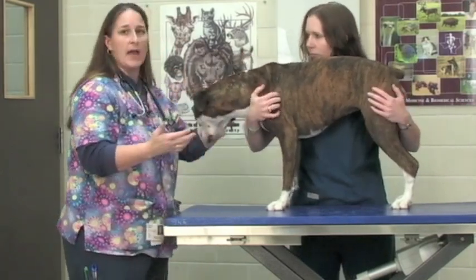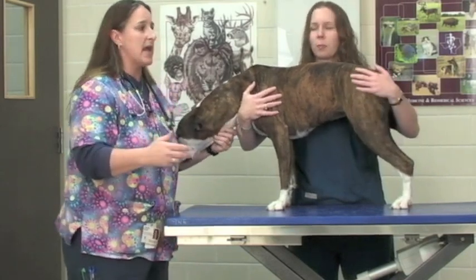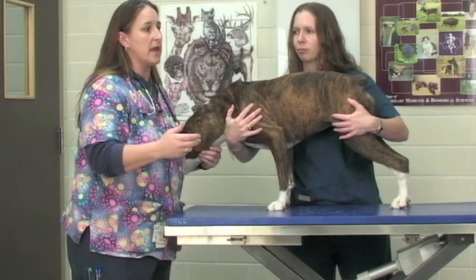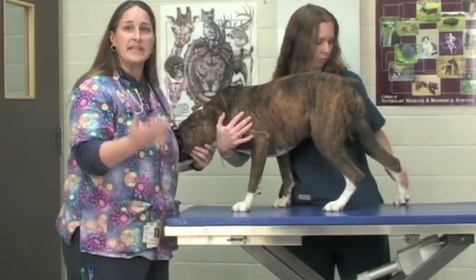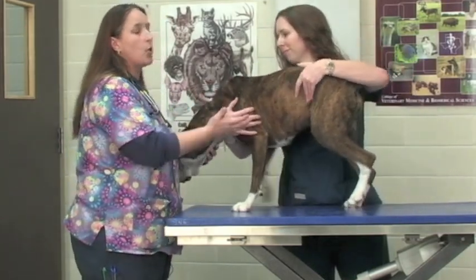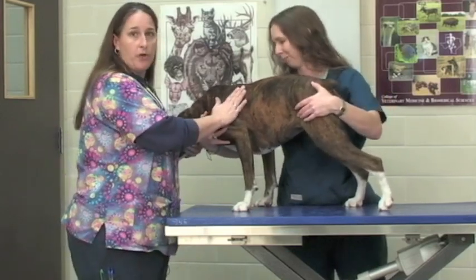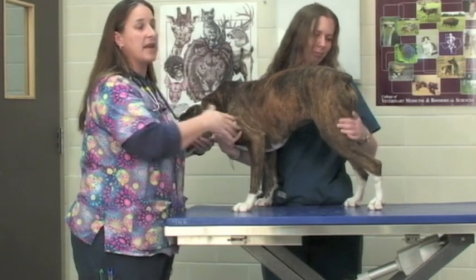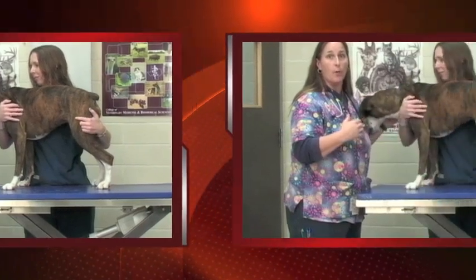When a patient arrives in our ER, we immediately take blood pressures and SpO2 so that we can make sure their oxygen saturation is good. We'll do an ECG to make sure their heart rhythm is good. We auscultate our patient, where we take our stethoscope, put it on their chest, and listen to their heart and lung sounds. I'm going to demonstrate some of these procedures for you and explain them as I go.